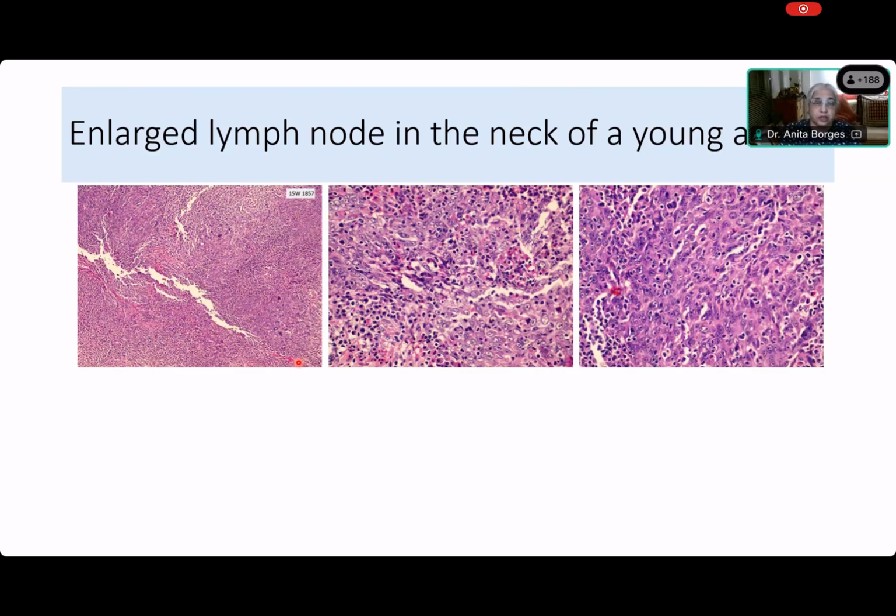Ma'am, I think this is a pleomorphic population. You think it's pleomorphic? All right. There is some degree of pleomorphism. I won't say there is none, but it's not marked variation. Do you think, Aishwarya, it's marked? No, ma'am, not marked. All right. Right.